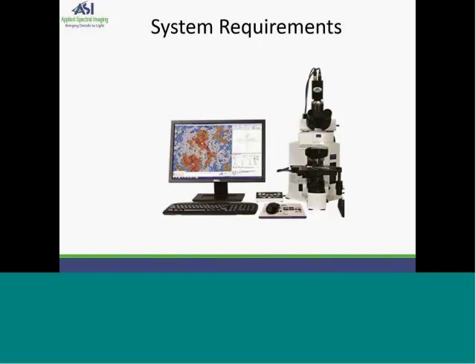Finally, some labs may have bright field scanning capabilities already in place with whole slide imaging or other solutions. In this case, our TissueMatch application is able to import previously scanned bright field images. The pathologist then marks the region of interest on the imported H&E image on whatever system the pathologist normally uses. The FISH analysis by the technician will take place on the automated fluorescent scanning system. And if this system is different than what the pathologist uses, the data flows between them over the computer network.